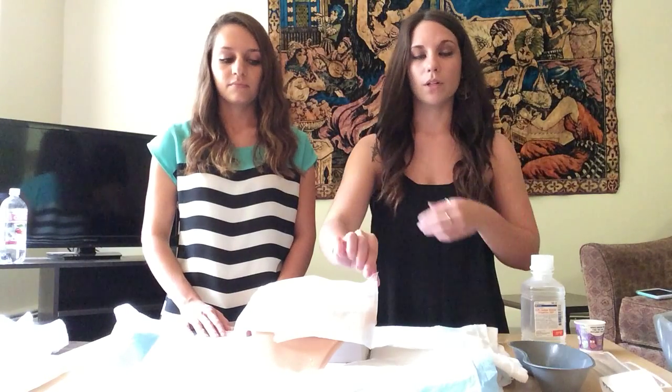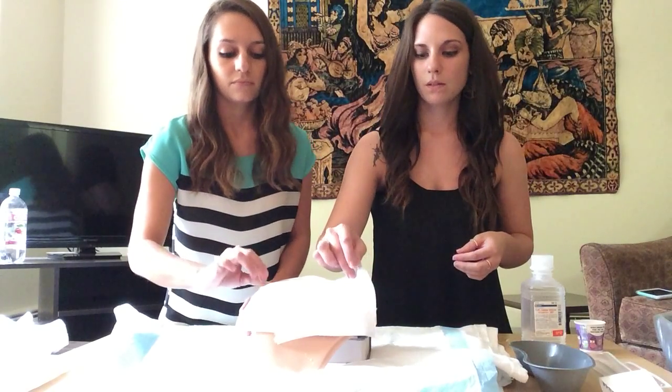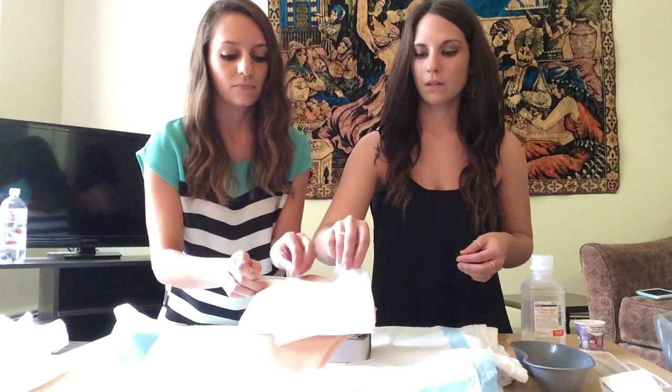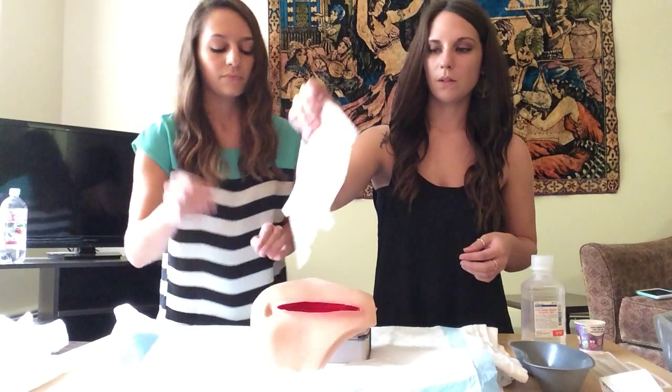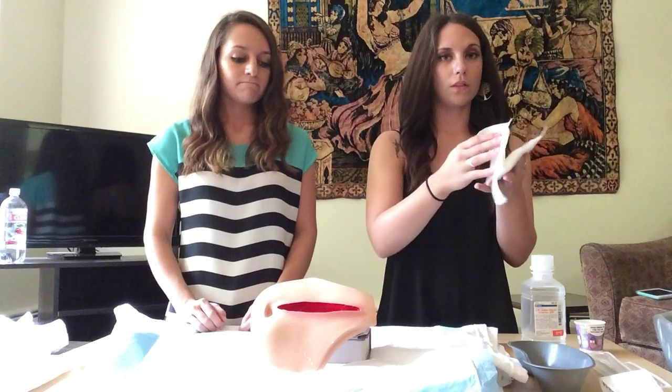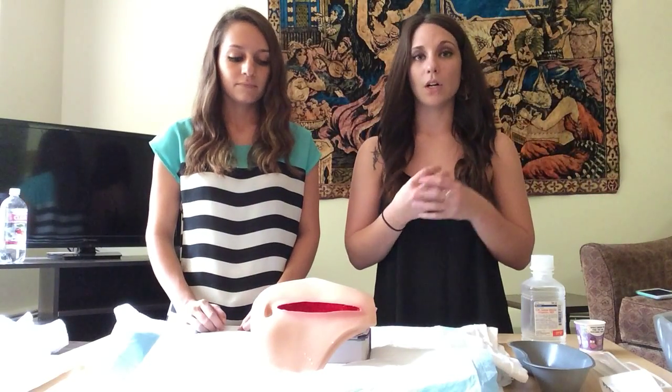After we position the patient, we would perform hand hygiene — I forgot to mention that in the steps earlier — and then don clean gloves. After putting on clean gloves, we are going to remove the dressing, starting from the edges or corners and working our way in towards the wound. We are going to discard the dressing and our clean gloves into the garbage.